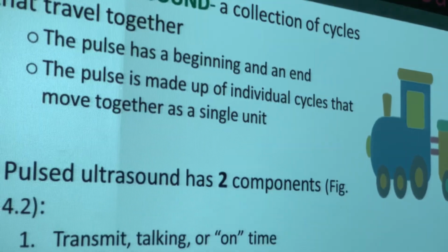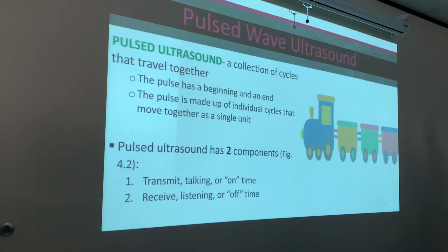I already talked about this a little bit. Remember, these terms are all synonymous. They all mean the same thing, so be careful if I say transmit, or talking, or on time. It has a component where it's sending and listening, talking and listening, on and off, transmit and receive. It's like communication. The first 2 cycles would be transmitting, talking, on time, meaning it's producing a pulse. Boom, I sent out that pulse. That's talking time right there.